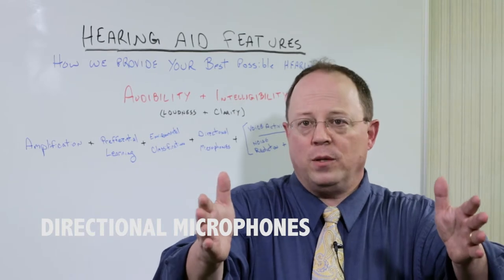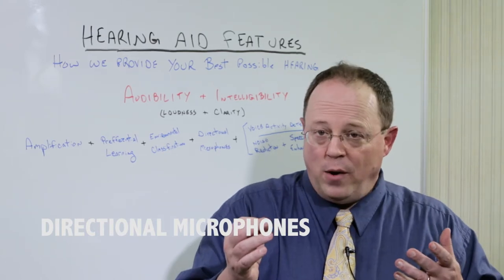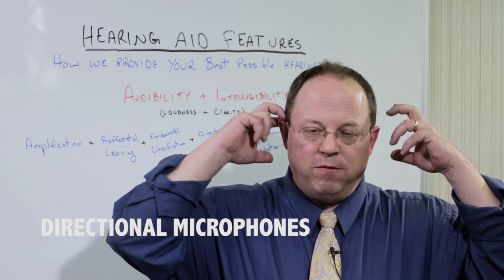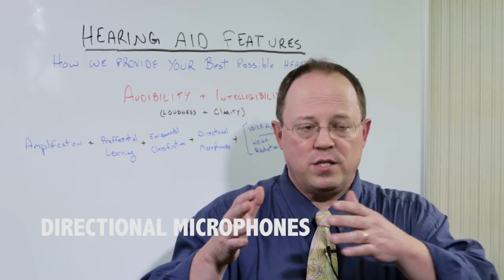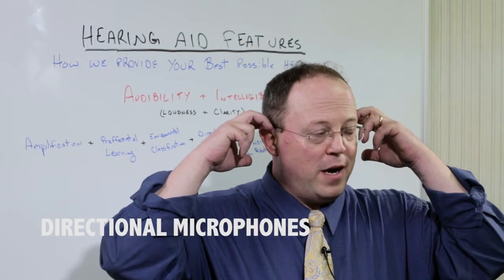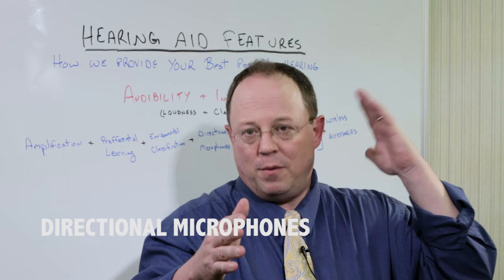The louder the environment, the more narrow the focus could become. But then the other thing they're now able to do is have all four microphones working together to triangulate on the person speaking. So even if I'm looking this way and you start to speak, the microphones will essentially focus their beam at you, amplifying you over top of all the background noise.